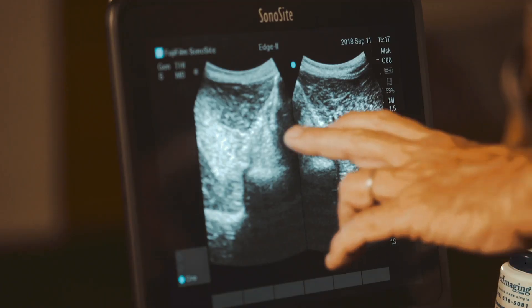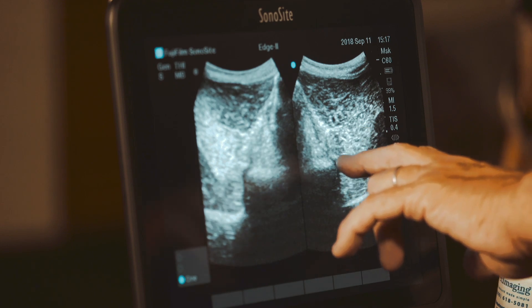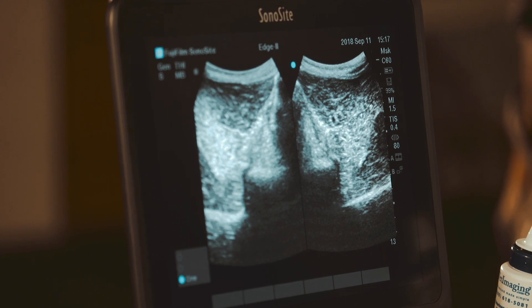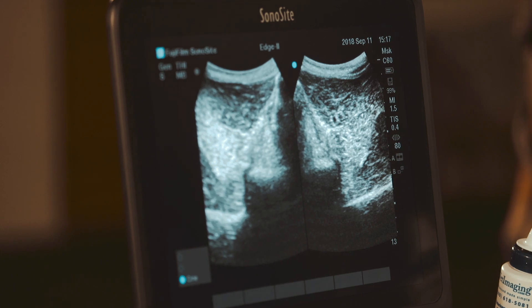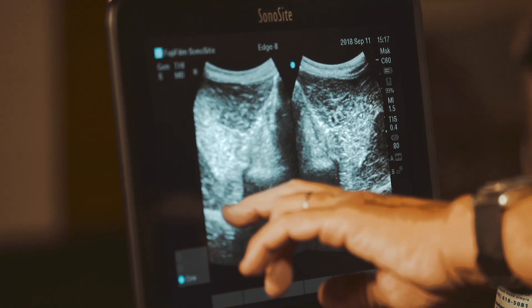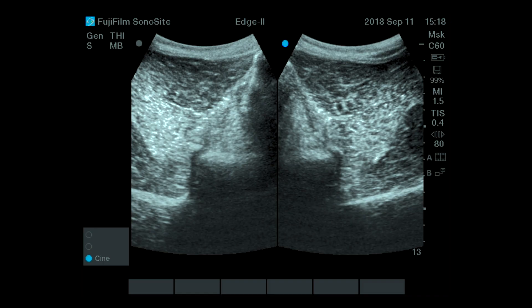The apophyseal joint on the left and right side should be smooth. You can sometimes see a gap which is the joint. You may have some remodeling with hyperechoic structures similar to potential bone formation around the apophyseal joint. You want to compare the longissimus muscle left and right, and the multifidus muscle shape left and right. The multifidus is a core muscle, so you can evaluate its size and shape to assess the horse's fitness or potential rehabilitation needs. Underneath are the transverse processes, the deepest structure you can see with your probe, with the psoas muscle below them.